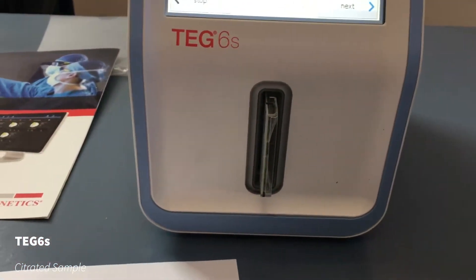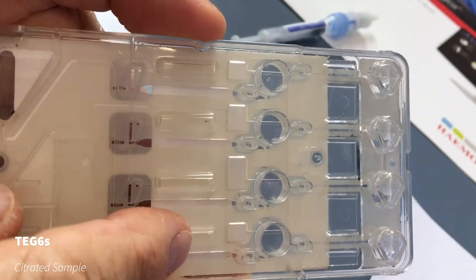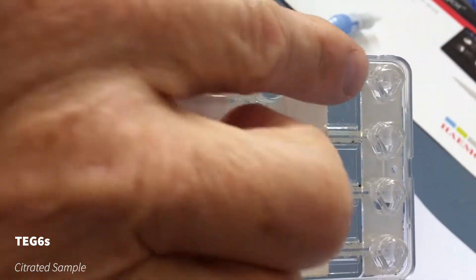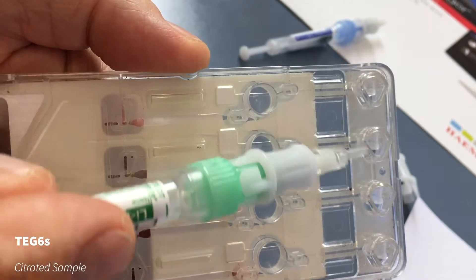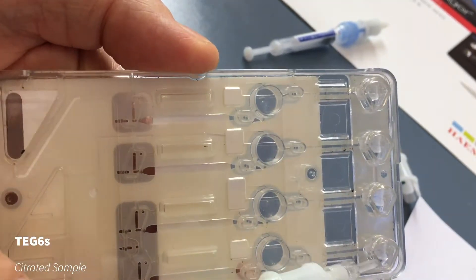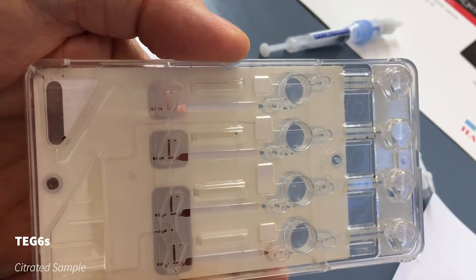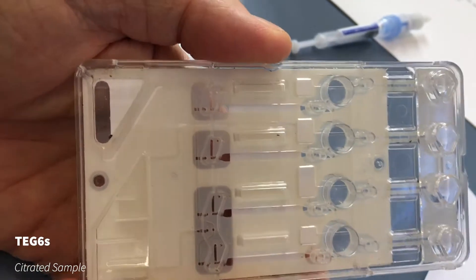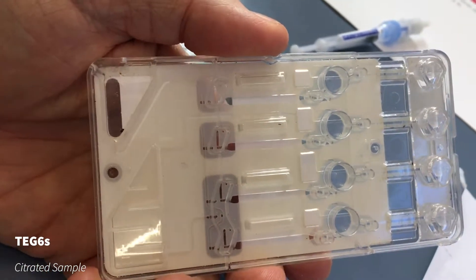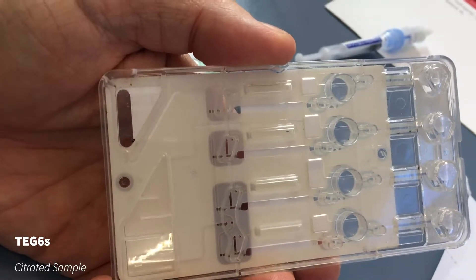It will then draw the sample through, mixing it with the reagents, and then it gets drawn through into what we call the hanging drop area — that's actually where the clotting process occurs. The noise you'll hear when the TEG is running is a resonant frequency that pings the hanging drop and shows what the movement in the clot is looking like. As that changes, the traces are created on the TEG device.